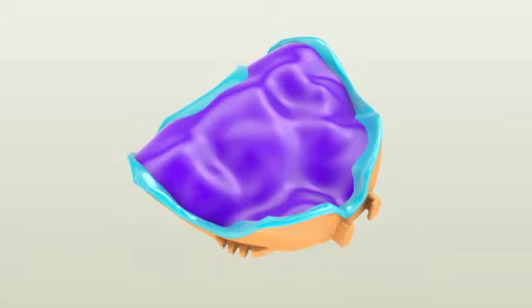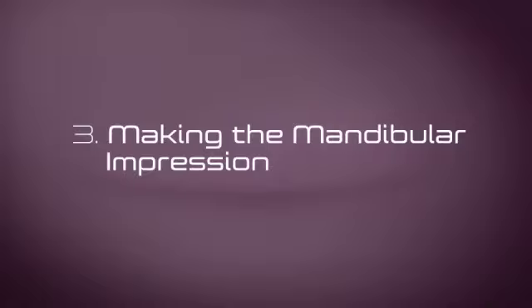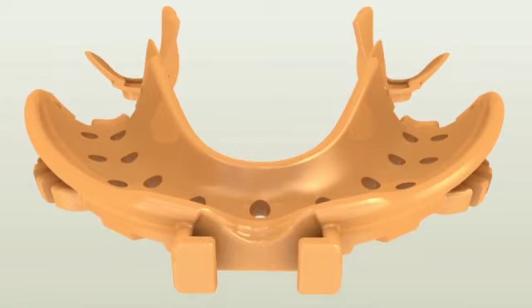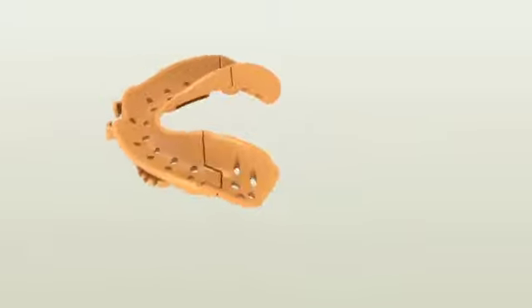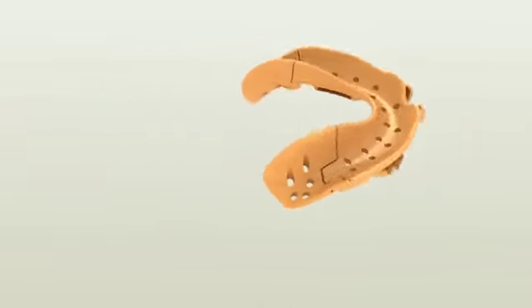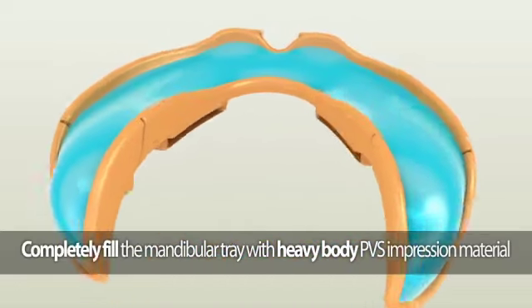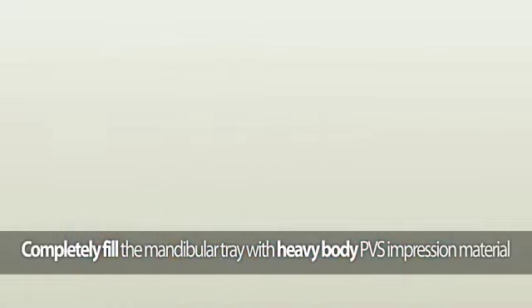Lightly cover the entire area with fast-setting light-body PVS material and repeat border molding procedures. Making the mandibular impression: the mandibular Pala digital denture tray consists of three pieces. Make sure the posterior pieces are securely attached to the anterior piece. Completely fill the mandibular Pala digital denture tray utilizing fast-setting heavy or medium-body PVS impression material such as Flexi-Time Fast and Scan.